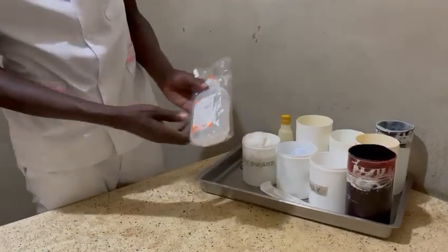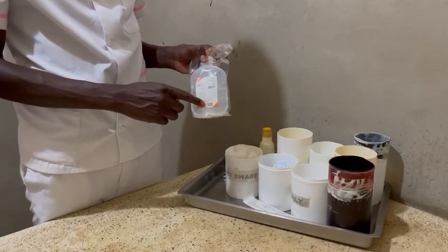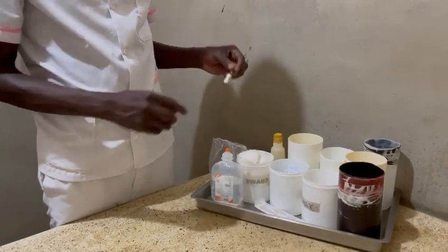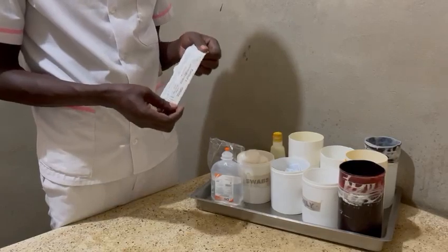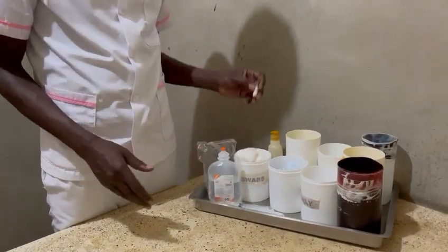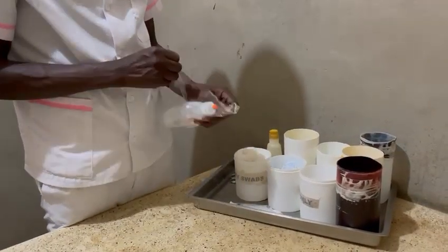We are going to use dextrose five percent to dilute. We are going to aspirate 18 mils of dextrose five percent and add two mils from this ampoule to make 20 mils. But since I don't have a 20 mil syringe, I'm going to aspirate 9 mils of dextrose five percent and then one mil of quinine from the ampoule.